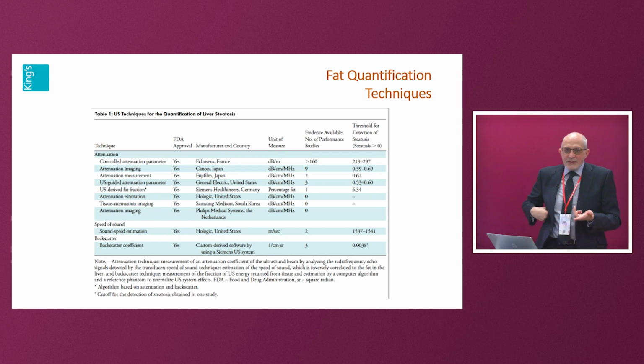If there's ascites, you don't get a measurement. If there's waistline obesity, you don't get a measurement. It measures in kilopascals, and the Young's modulus equation measures it in meters per second. So meters per second is converted to kilopascals, and then there is inaccuracy in that measurement. Radiology machines all measure in meters per second, which is the correct thing, but you can toggle between the two.